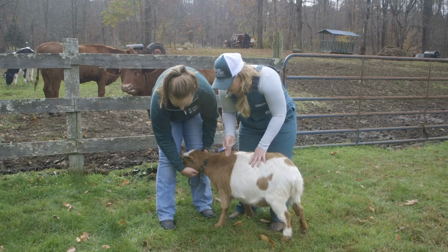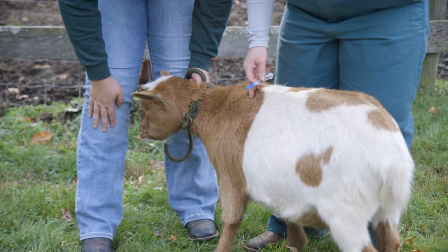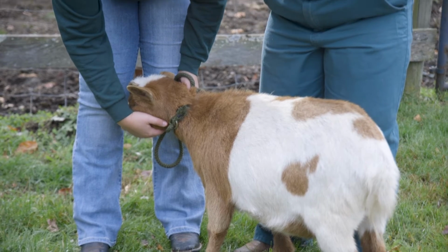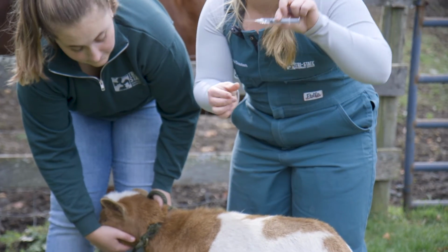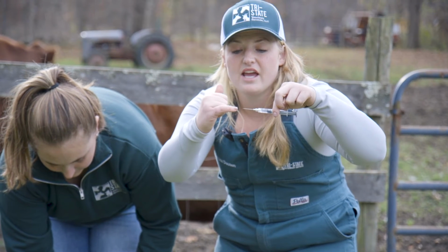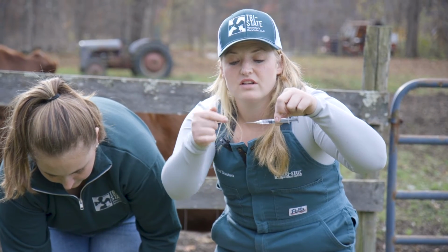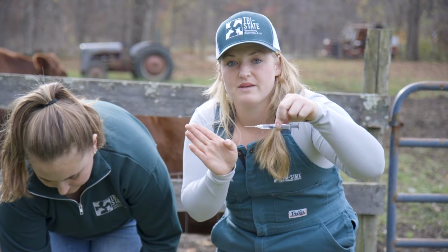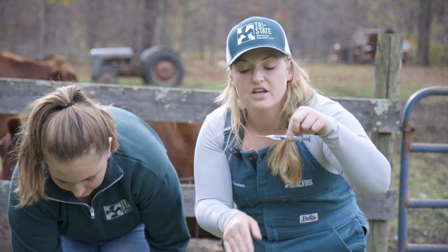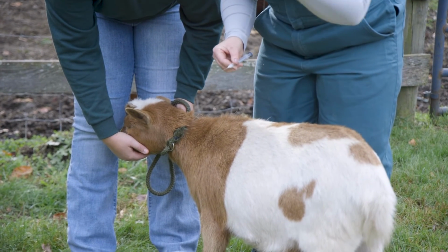When you're giving the medication, I always recommend either having the animal restrained in a stand or having an assistant holding. What I like to do is make sure the needle is bevel up. What that means is when you're looking at the needle, there is a longer, sharper end to the needle. There is also an angled hole. What we call the bevel is where that hole is. So that is where the medication's coming out. The sharp piece is what's gonna go into the animal and cut through the skin.